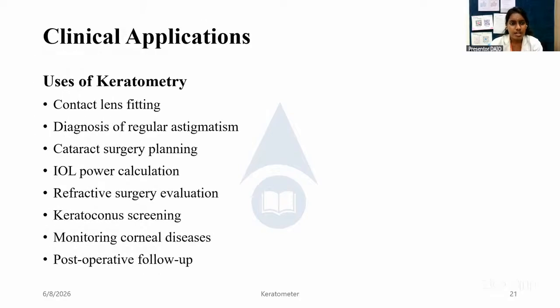Clinical applications. Uses of keratometry. It is used in contact lens fitting, diagnosis of regular astigmatism, cataract surgery planning, IOL power calculation, refractive surgery evaluation, keratoconus screening, monitoring corneal diseases, and post-operative follow-up.